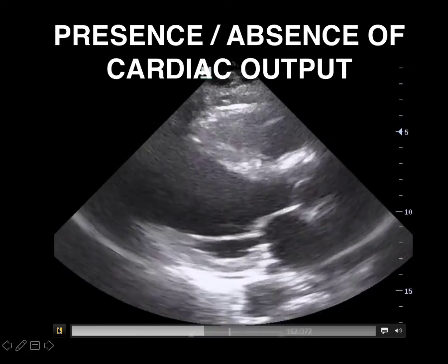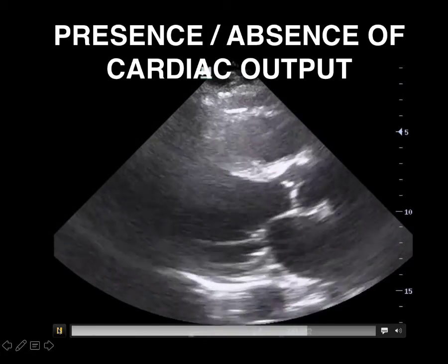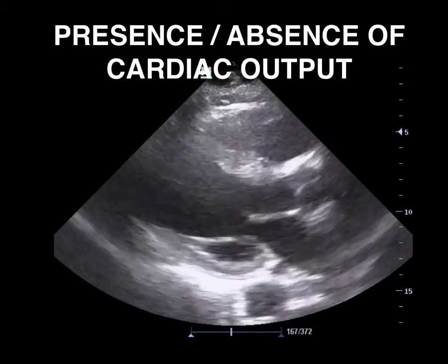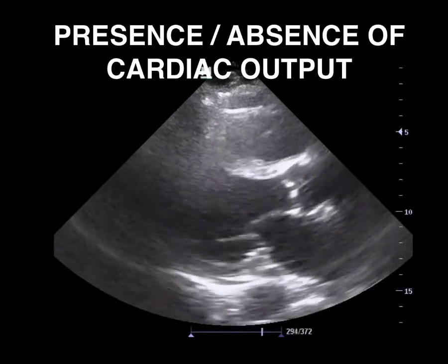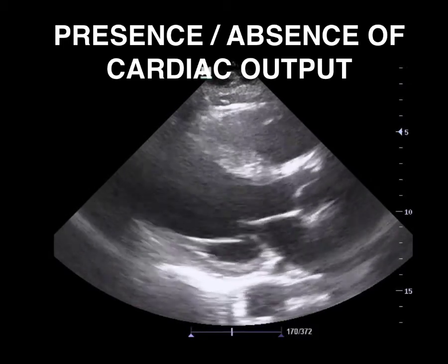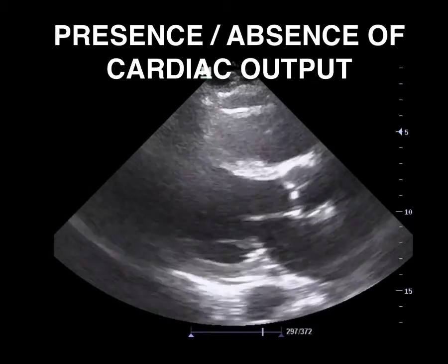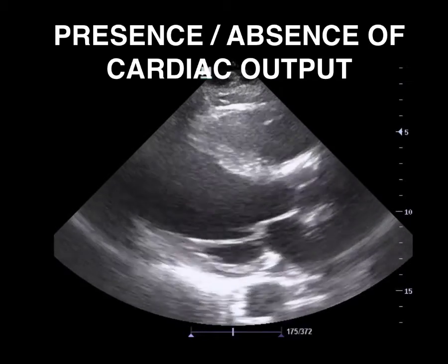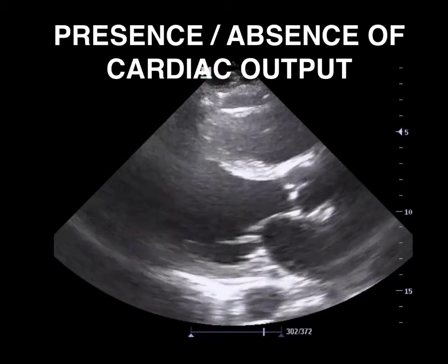This is a patient that was brought in by our EMS group with ongoing chest compressions. On the monitor, the patient had an organized electrical activity with very, very low voltage, which was thought to be due to the obesity. On my first look in ultrasound, this is what I saw during the time that the patient was being connected to a monitor. So what do you think?